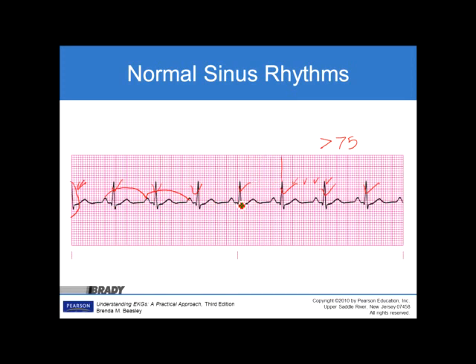We should look at least a couple areas on here. 1, 2, 3, 4. We have 4 boxes, which is 0.16. Each small box is worth 0.04. And let's look at another spot. Here. 1, 2, 3, 4, and this one as well is 0.16, or 4 small boxes.